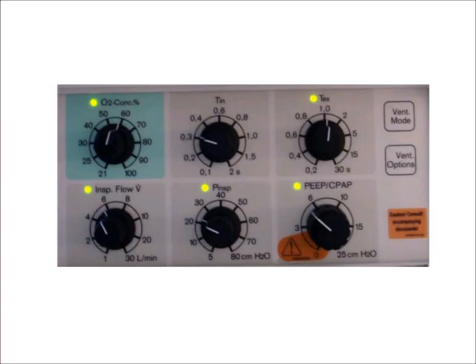Now, how does one set expiratory time? This is not that common in newer ventilators where you actually set an expiratory time. There's usually not settings. However, this older ventilator, from a Babylog 8000, we actually did set an expiratory time. And as you notice, if you look at all these control settings, there is not a setting for my frequency.